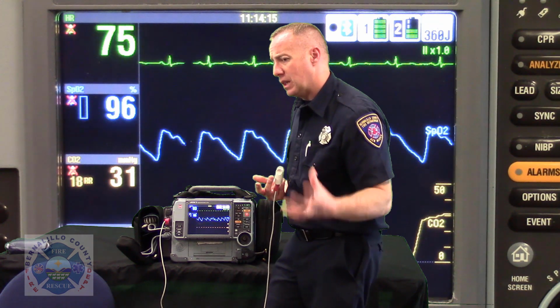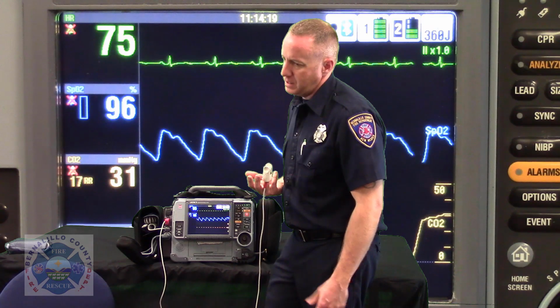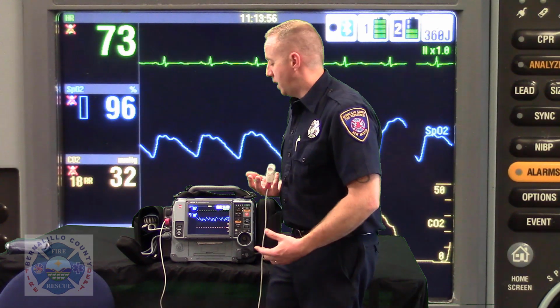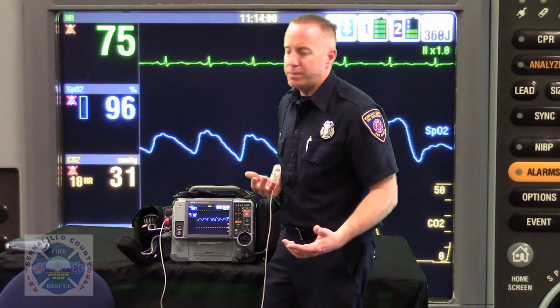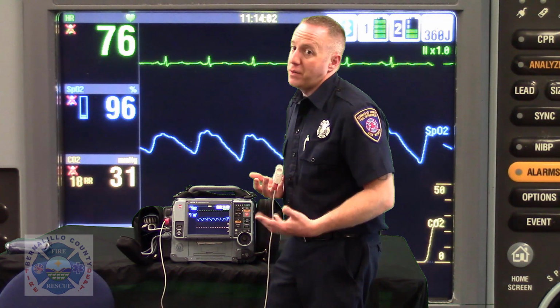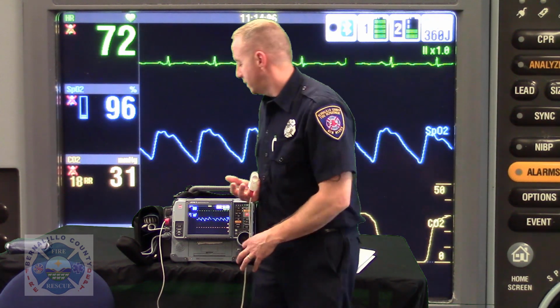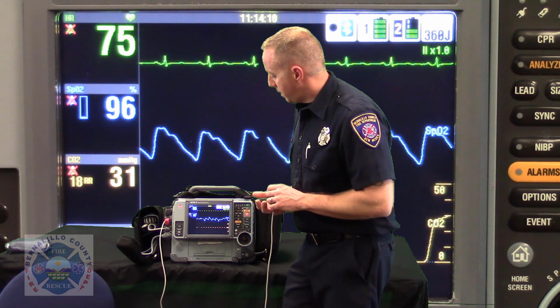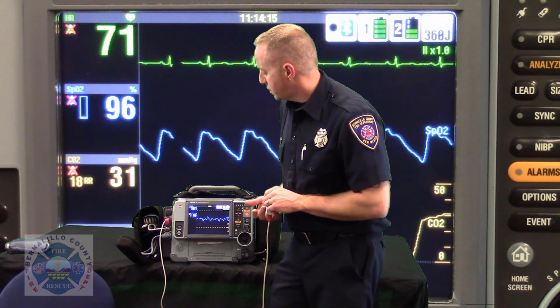And if you consider the lub-dub of valves closing, that's pretty remarkable that you can see that activity indicated at the capillary level. That's nothing that's going to change your clinical course, but you can see how I know that I have a heartbeat. I don't just have electrical PEA heart activity. So that's fascinating. That's another clinical tool for you to add to your SpO2.